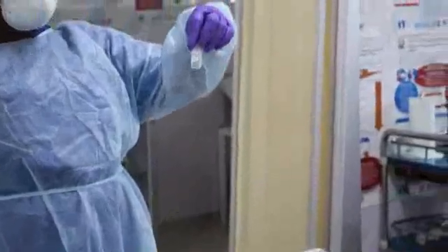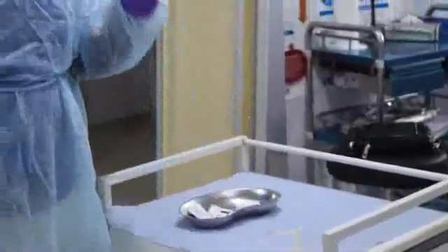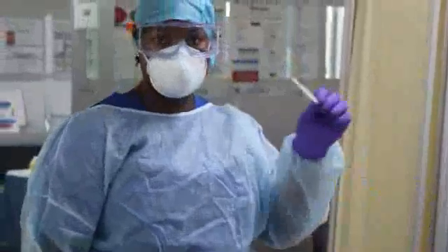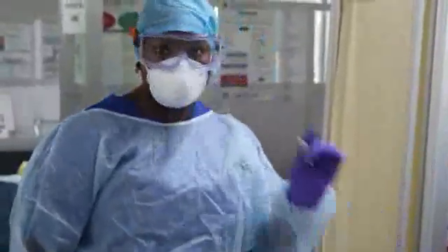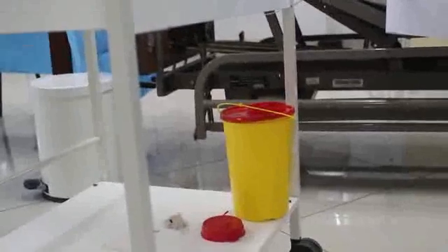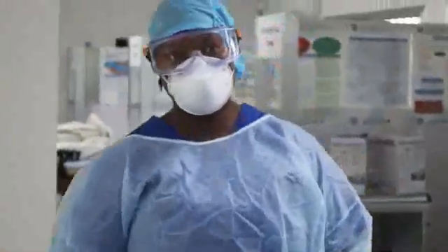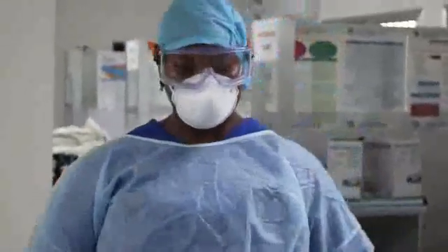This one is 10 milligram. I have my syringe. I also have my needle. Then I have the subcutaneous cannula. I have an alcohol swab. Underneath the trolley, you'll see the sharp box. Subcutaneous route allows medication to absorb slowly.